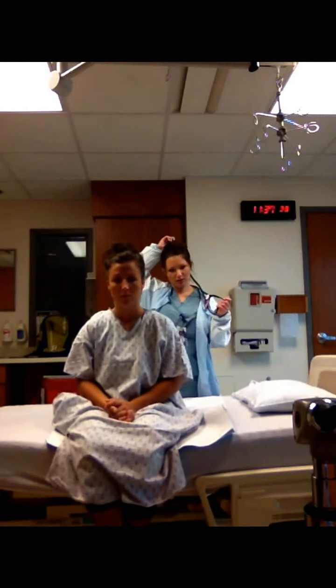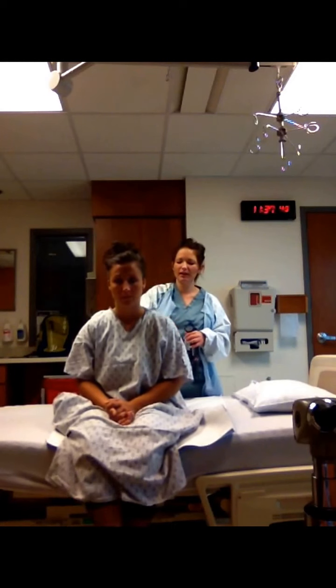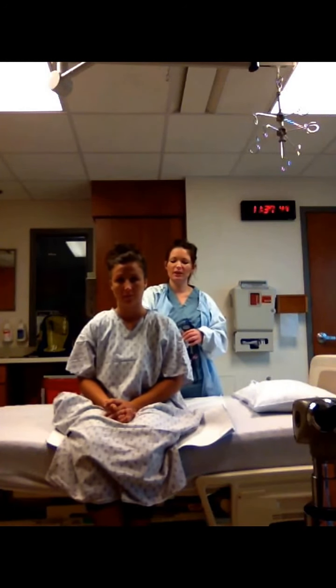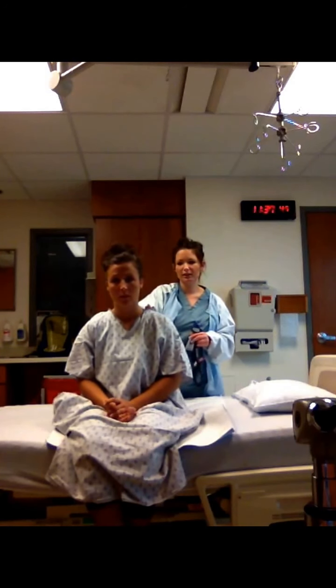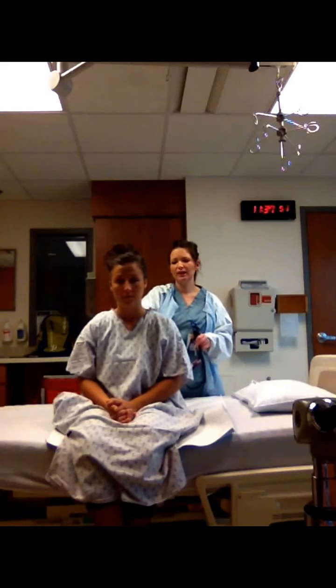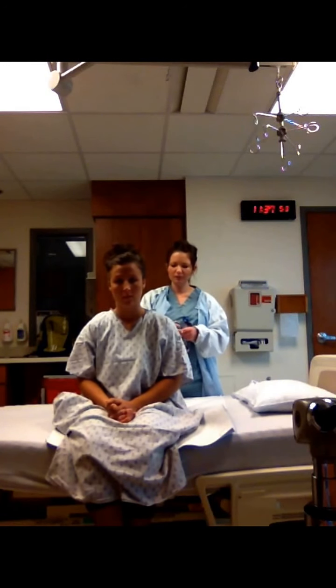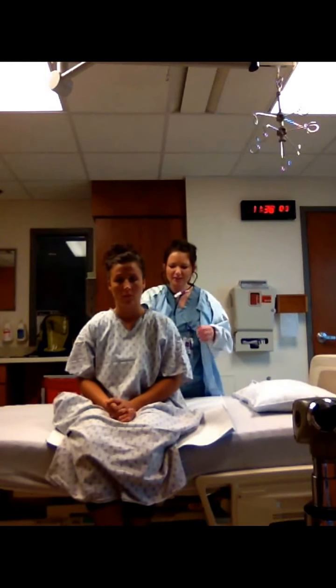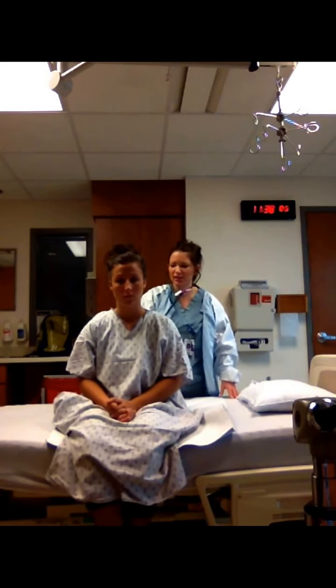Okay, I'm going to also listen to Courtney on the back side. And your landmarks, you're going to be listening at the first intercostal space. The important thing about a lung assessment when auscultating is comparing your right side to your left side. So we'll go first intercostal space, second, third, fourth, fifth, all the way to ninth mid-axillary line. Every time I lay my stethoscope down, Courtney, I want you to take a good breath for me, okay?